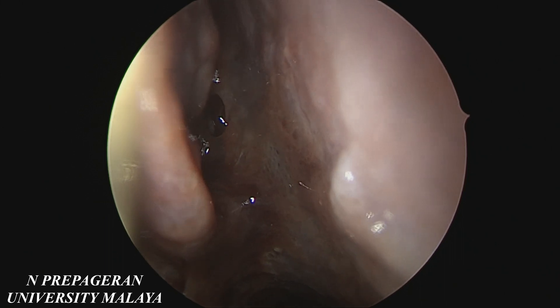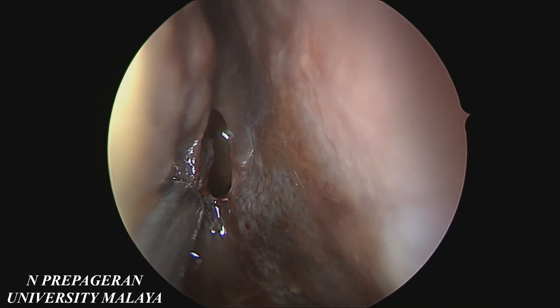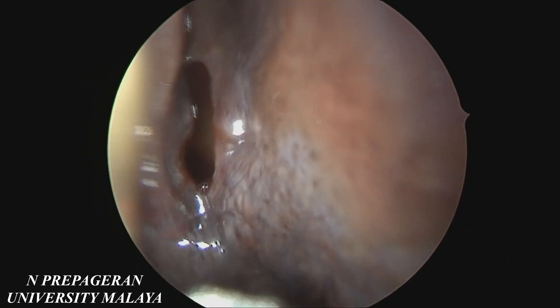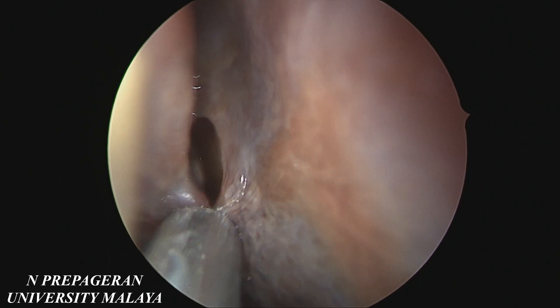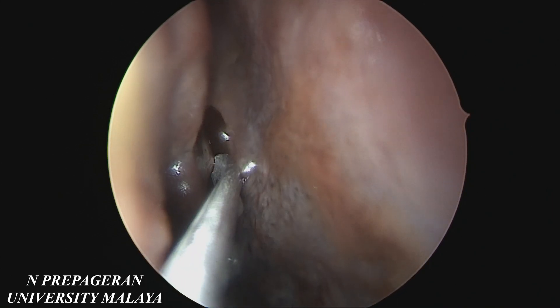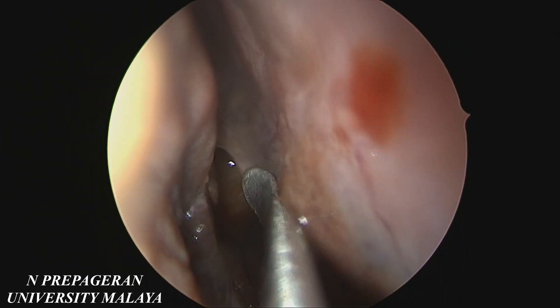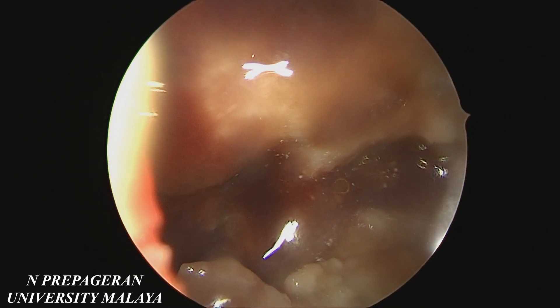So that's the sphenoid ostia as you can see. So if you are doing a functional surgery for the sphenoid, this and the supreme turbinate here as well — middle turbinate, superior turbinate, supreme turbinate — and exactly in the middle of this, a few millimeters above the posterior choana, you will find the sphenoid opening. If you want to do a functional surgery for the sphenoid where the function is preserved, all you need to do is enlarge it inferiorly and medially, preserve the mucociliary clearance all around the edges. Do not damage the mucociliary clearance and you are in fact inside the sphenoid sinus.